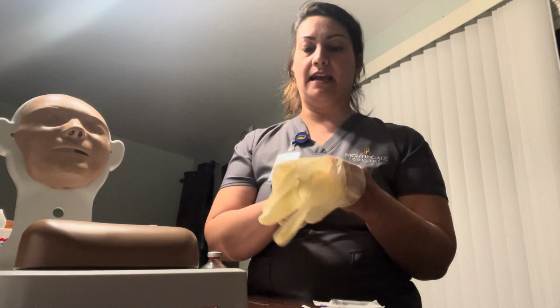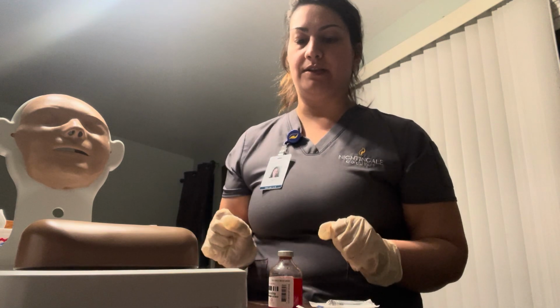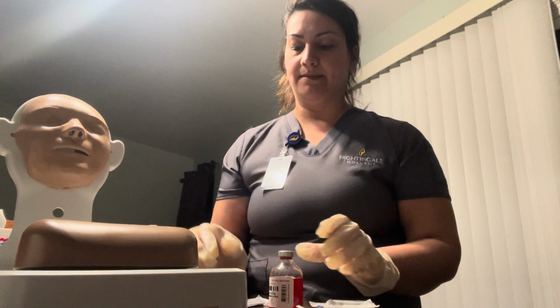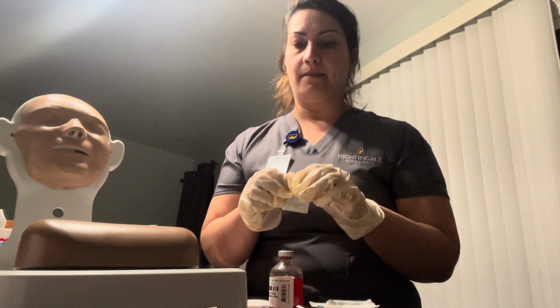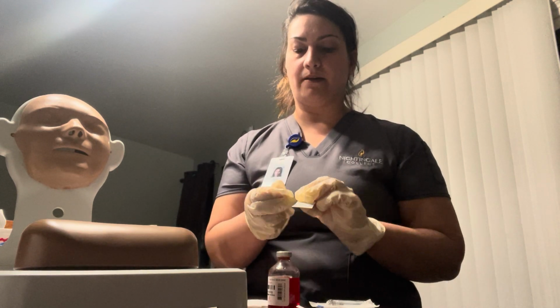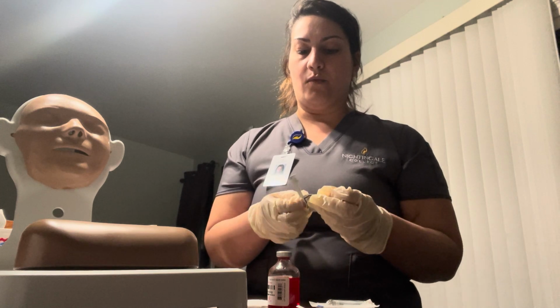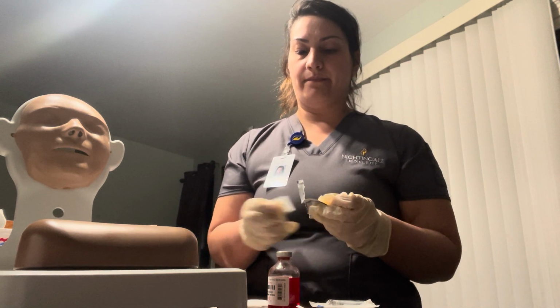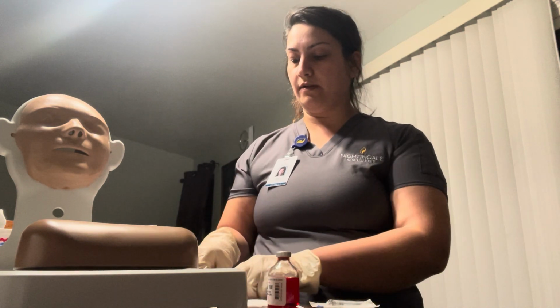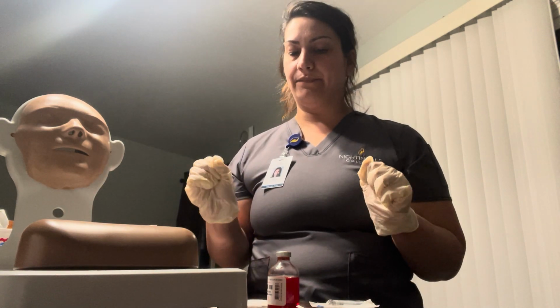And I will get my medication ready. So our patient is going to receive morphine sulfate 1.5 milligrams. So I'm going to start, and we're going to confirm in the system, in the EHR, and I'm going to start by wiping with my alcohol wipe. Make sure that this is nice and clean. I will dispose. I will let that air dry. I will not touch it.